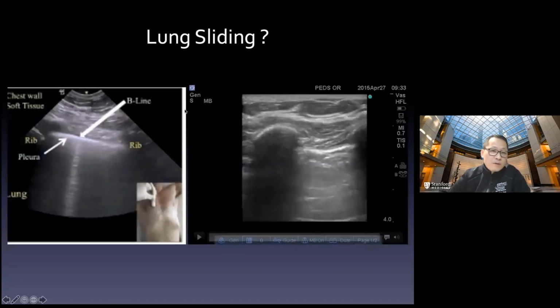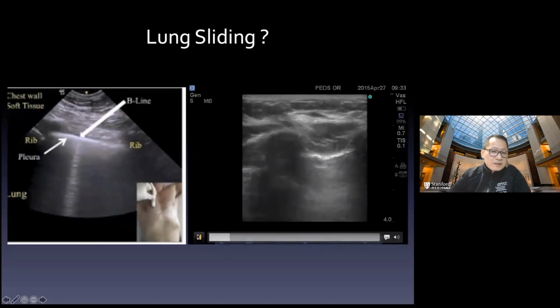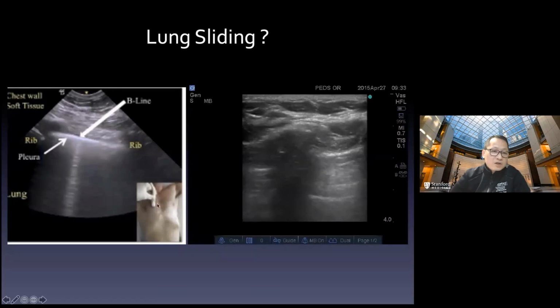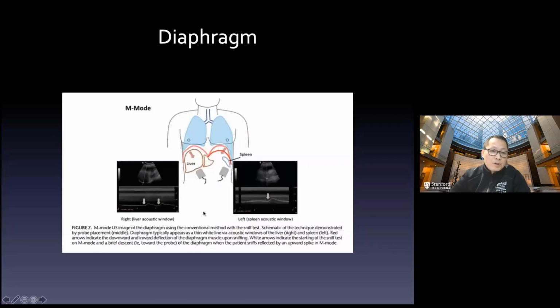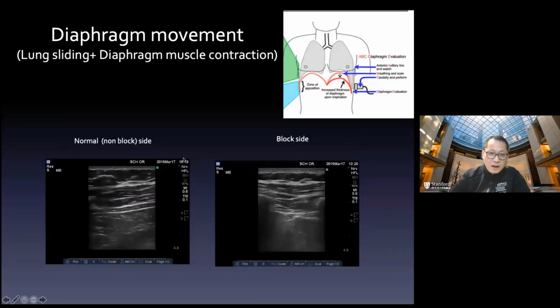Now, traditionally, sometimes people tell me, oh, they have lung sliding, but it's hard to tell if it is actually ventilating. Lung sliding is principally used to determine whether there is a pneumothorax, any air in between. But if you want to see the actual lung movement and ventilation, we have to look more at the side, and also the position of the lung, so that we see the lung sliding down and opening up. But traditionally, this way is difficult. So what we've been doing is a so-called intercostal method.